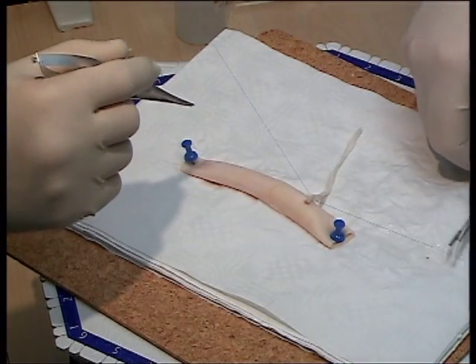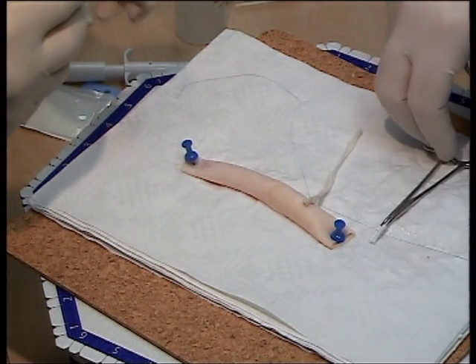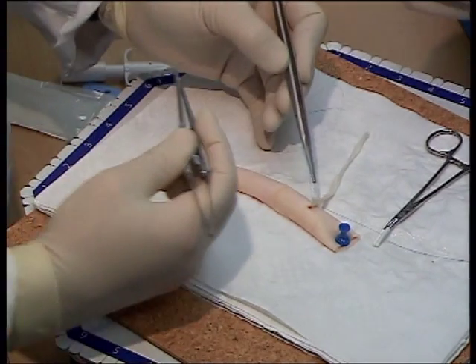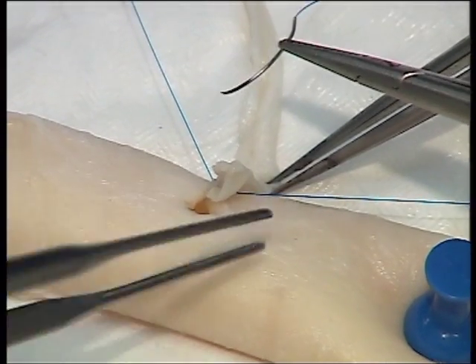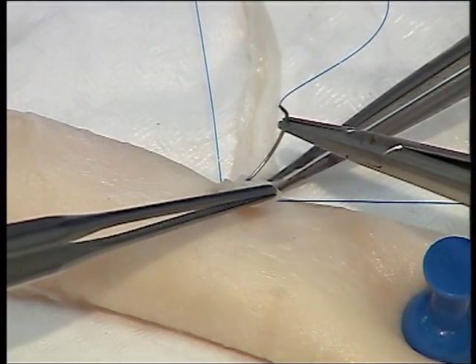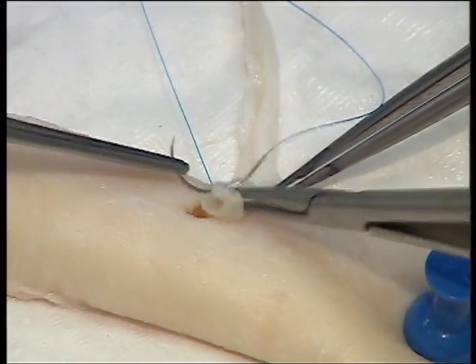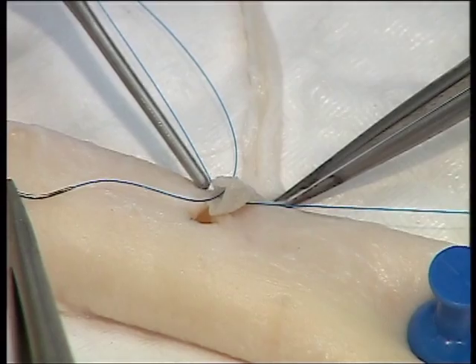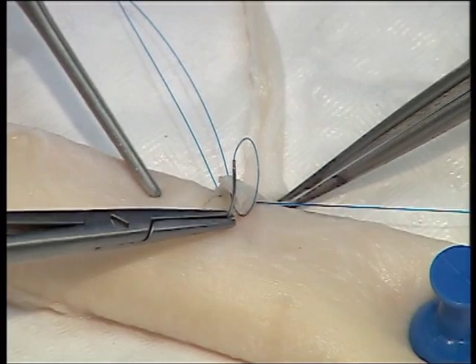Pass one end of the suture underneath the conduit and secure with a shod artery clip. When performing the rest of the anastomosis, it may be helpful to think of the hole in the aorta as a clock face and space your sutures in the conduit appropriately. The first suture passes from outside the conduit to inside, and then from inside the aorta to outside at the 11 o'clock position.